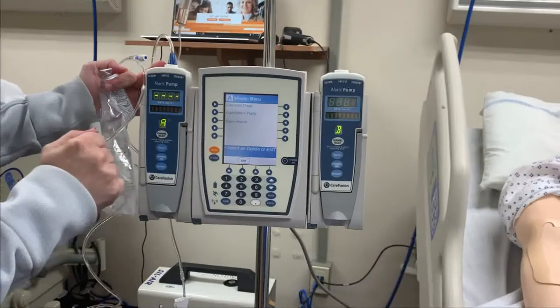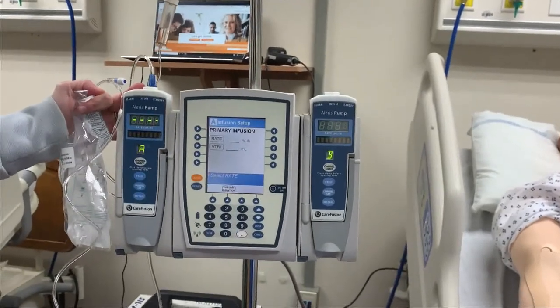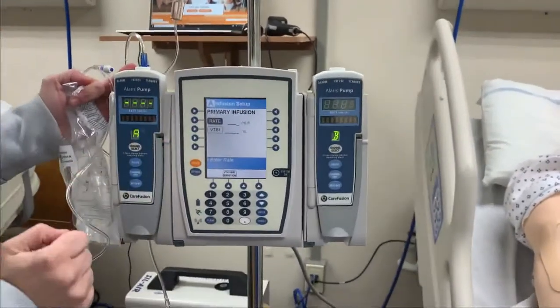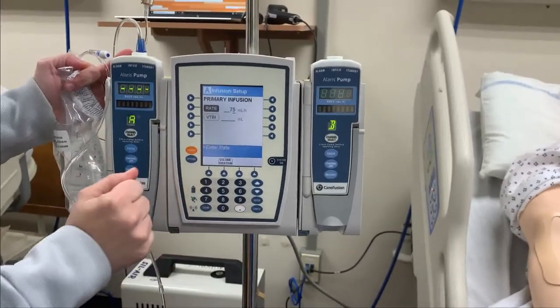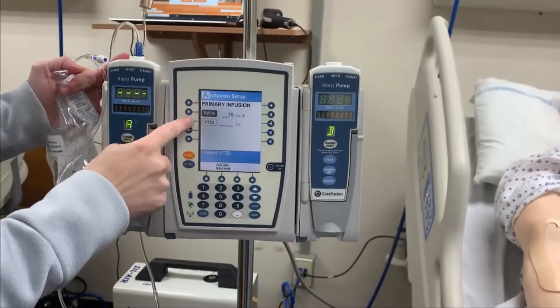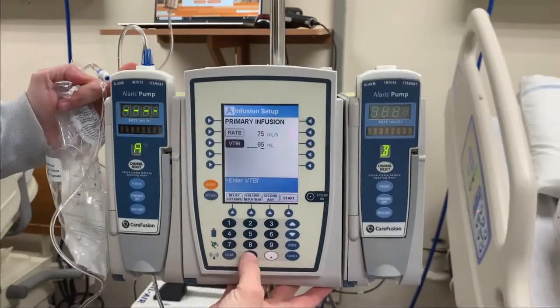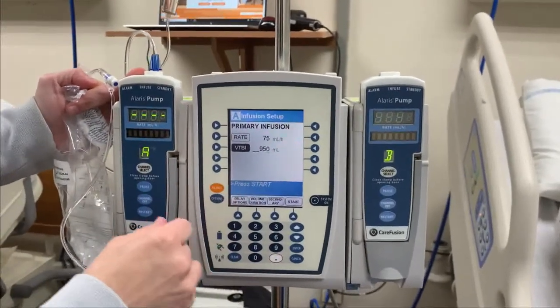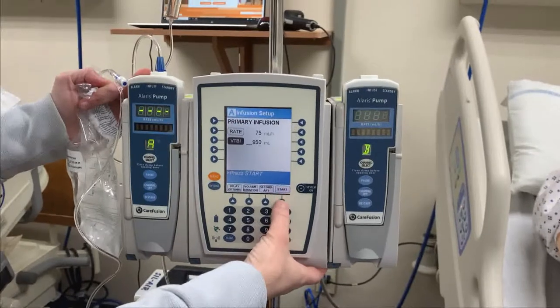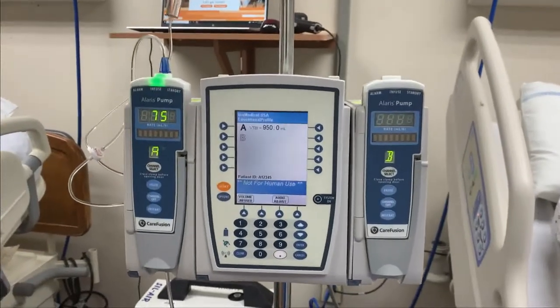We've already selected channel A, basic infusion. Now I need to put in my rate and volume to be infused. The doctor has ordered a rate of 75 milliliters an hour, so I'll click on rate using my numeric pad: 75. Once I'm good with that, I can use my arrow beside VTBI — volume to be infused. I have a thousand milliliters, so I'm going to set it to 950 so it will give me an alarm before it fully drains the bag, giving me time to get a new one. It says press start — that's your start arrow at the bottom right. Once you've selected start, it's infusing into your patient.